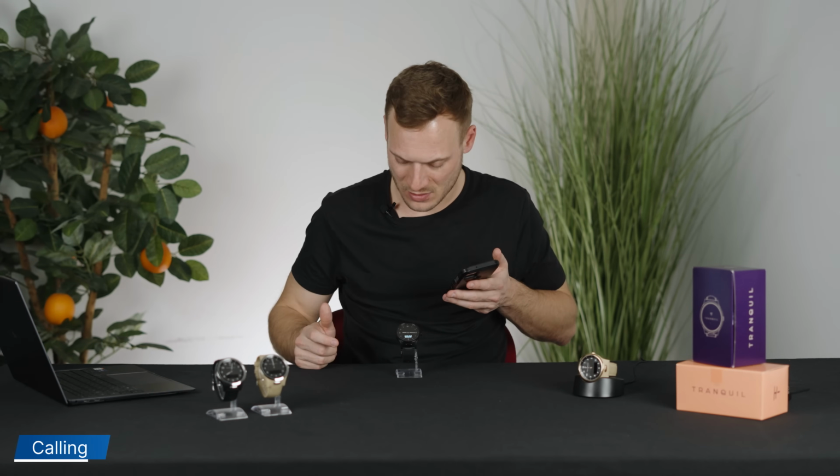This is a help request call from user. Press 5 to answer the call.